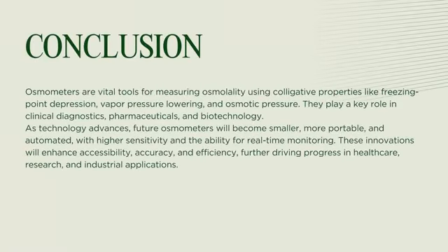In conclusion, osmometers are essential instruments that measure osmolality by taking advantage of colligative properties such as freezing point depression, vapor pressure lowering, and osmotic pressure. These devices are invaluable in clinical diagnostics, pharmaceuticals, biotechnology, and chemical research, with each type tailored to specific application needs.